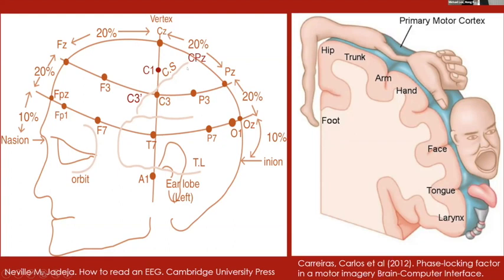Some of us may mention, oh, that is 20%. So how about 10%? The 10% we will say is between the CZ and PZ, so it's called CPZ. Okay. So this is the central sulcus. You can see that it's crossed. This line actually is not in line with your numbers here. It's a little bit in front of C3. So sometimes if you want to stimulate the motor cortex, we will say, oh, this is C3 prime. This is a little bit from the C3, okay?